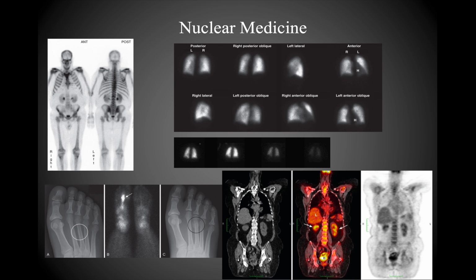The structure labeled L there is of course the liver, and then right below that, on either side, you can see the kidneys lighting up, and then obviously in the midline in the low pelvis you can see the bladder with that bright yellow coloration to it.